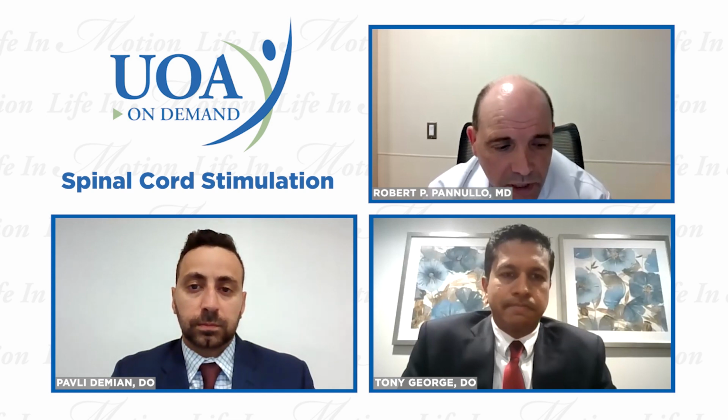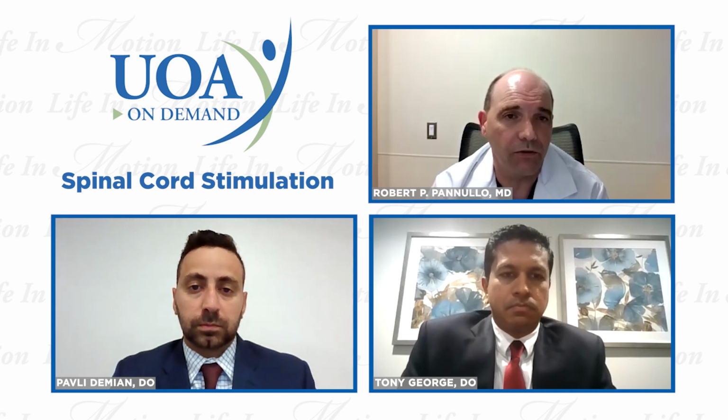And this is not a first strike procedure. It's one that comes about when patients have had multiple procedures done beforehand, including spinal injections, maybe even spinal surgery, months of physical therapy, medications. And essentially, we're looking at what can we do here for this problem, this nerve problem?